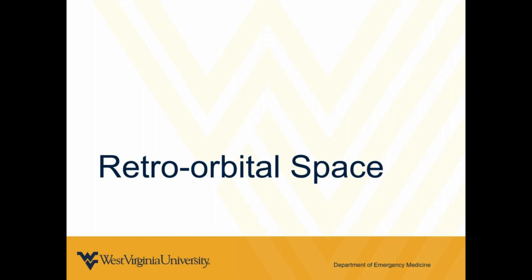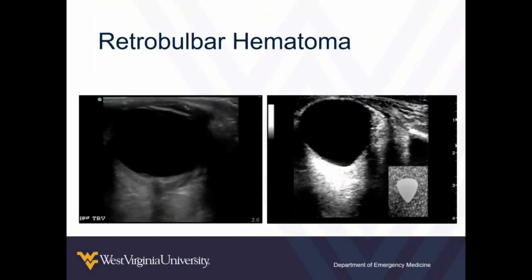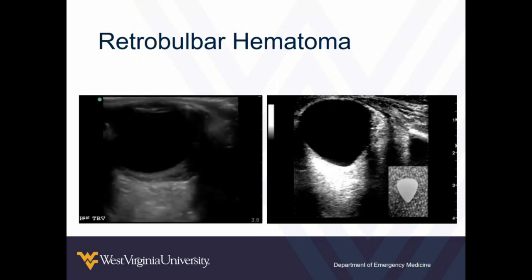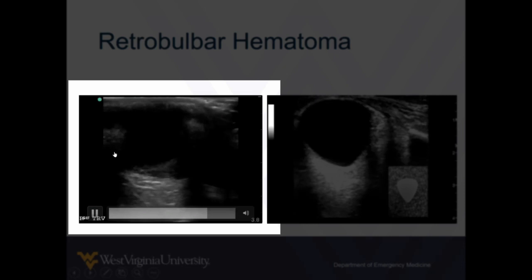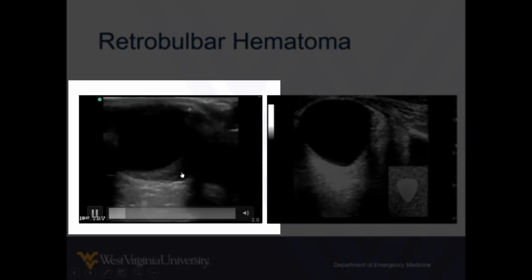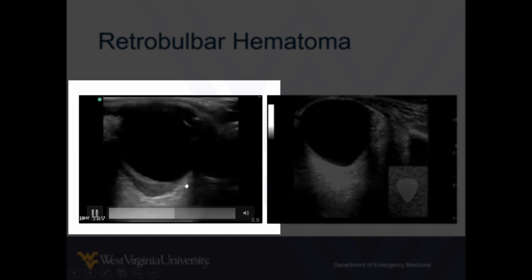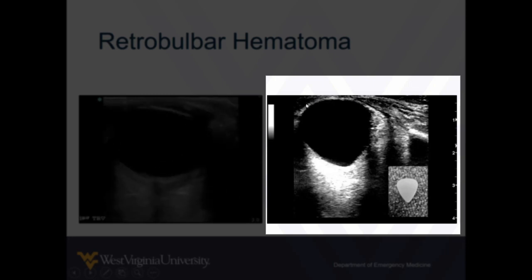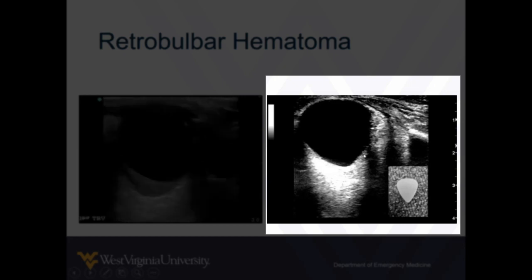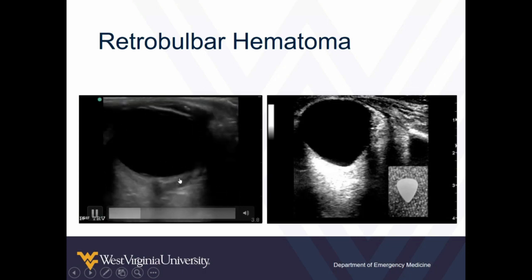Just a couple of things we can recognize in the retroorbital space. In some scenarios, patients have either infectious processes or trauma that causes bleeding in the retroorbital space, and we can recognize that with ultrasound. Here we can see some blood that's behind the globe itself. Or sometimes you might see what's been called the guitar pick sign, where there's swelling from either an infectious process, tumor, or blood that's distorting the shape of the eyeball so it looks a little bit like a guitar pick. Those are some of the things you can recognize in the retrobulbar space.